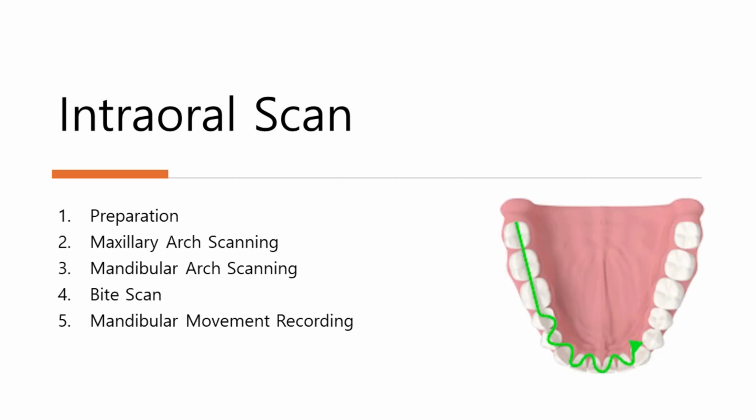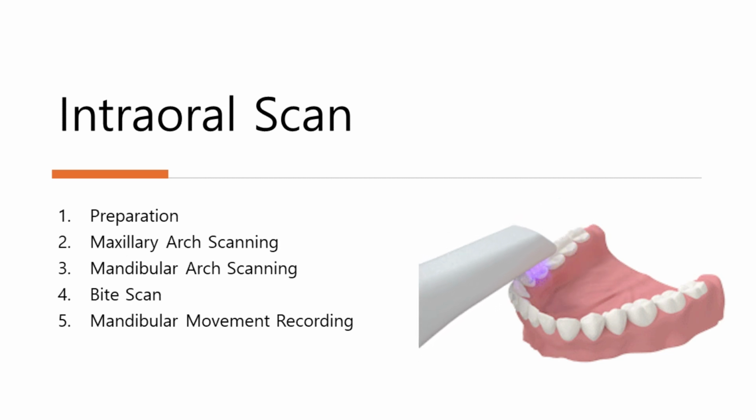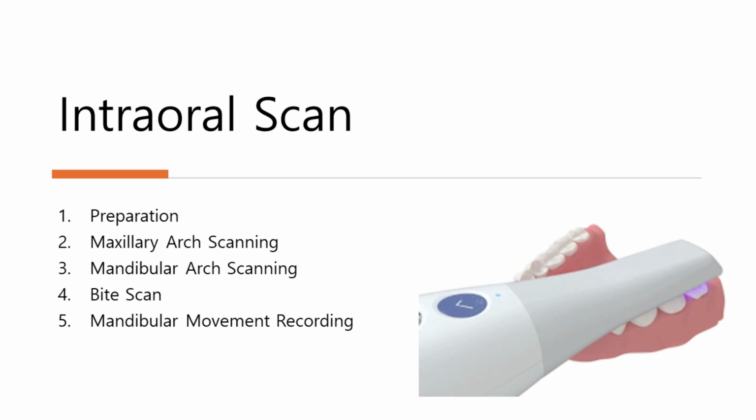3. Mandibular arch scanning. Similar to the maxillary scan, start with the occlusal surfaces. Proceed to the lingual surfaces and finish with the buccal surfaces.